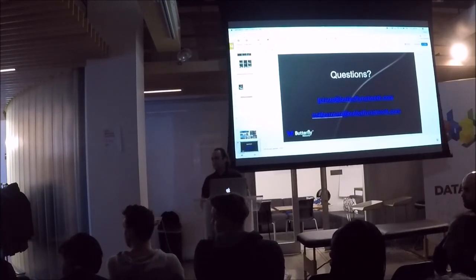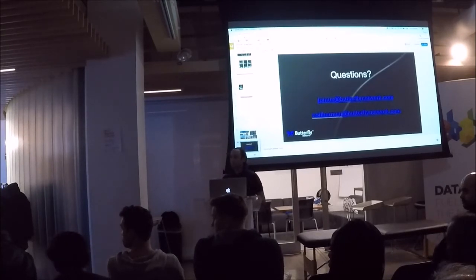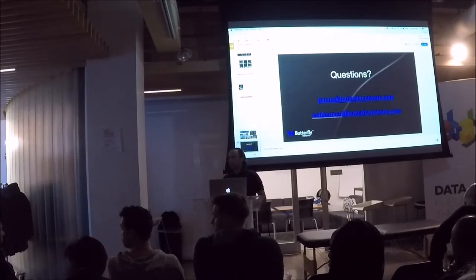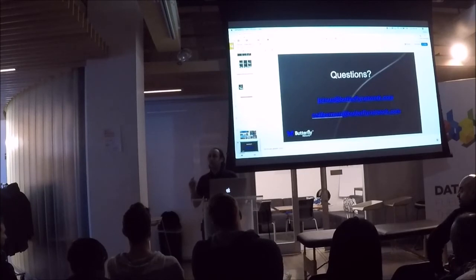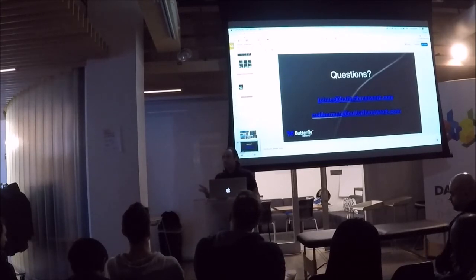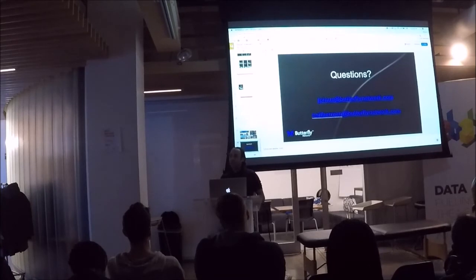So I can see why domain adaptation would be good if you're just trying to train a classifier, like transfer image classification from the target to the source, or source to target. But what if you're trying to do segmentation? You're not also translating the segmentation, right? So actually, segmentation is a great example of something that is a more powerful task tower. Think about it this way: that example I gave of the heart, where we could have changed one heart to still look like a plausible heart, but it was clearly a different one. The segmentation effectively is a much more particular set of constraints that the network needs to adhere to in order to do its job successfully.